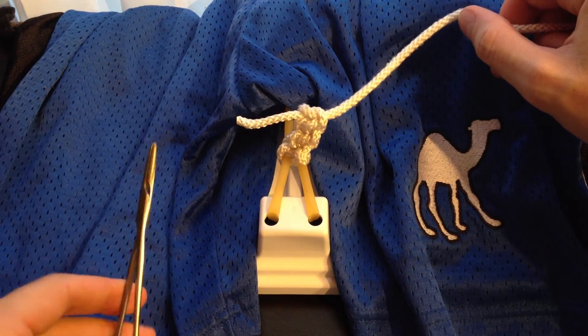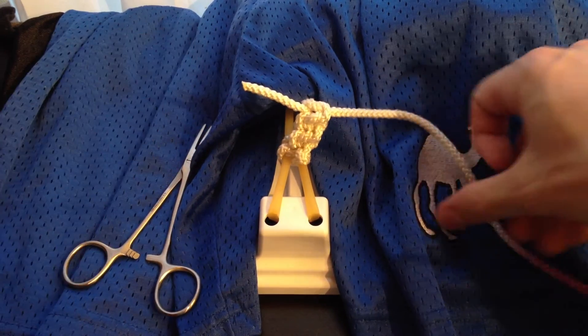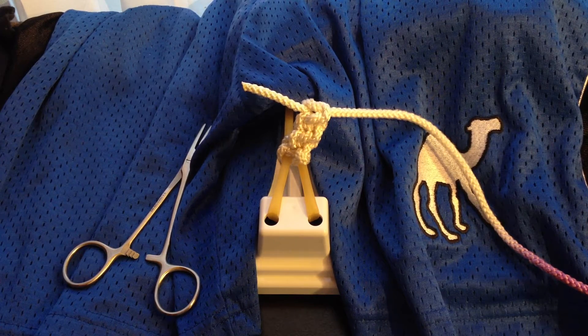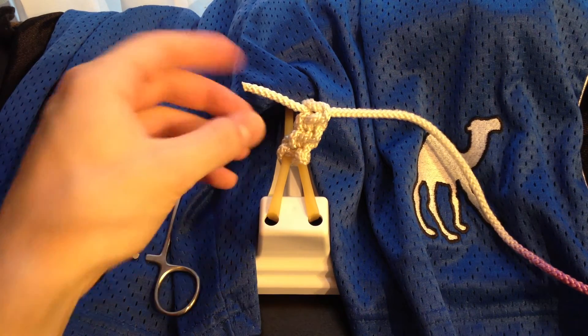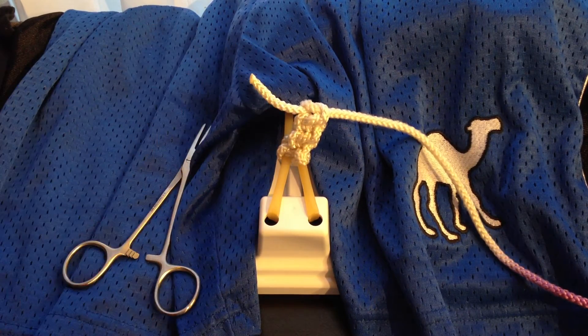It's a little bit harder to see with just the white string, but these are all square knots. So that's it — that is the instrument tie for lefties. This is a quick knot, it's very easy, and as you can see, you can tie it with a very short amount of thread. This allows you to tie many knots with the same piece of suture and save some money in the process. So keep practicing this — you're going to use this a lot in the OR. Thanks for tuning in and good luck.